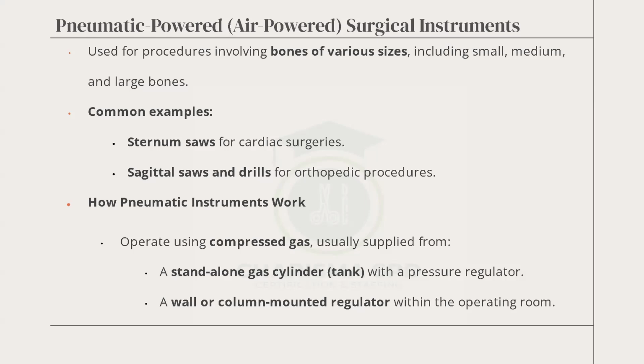The air will power it. Some also have cylinders in the OR that they connect the hose to, and then they compress. They use the air to get the power for the instrument to work.